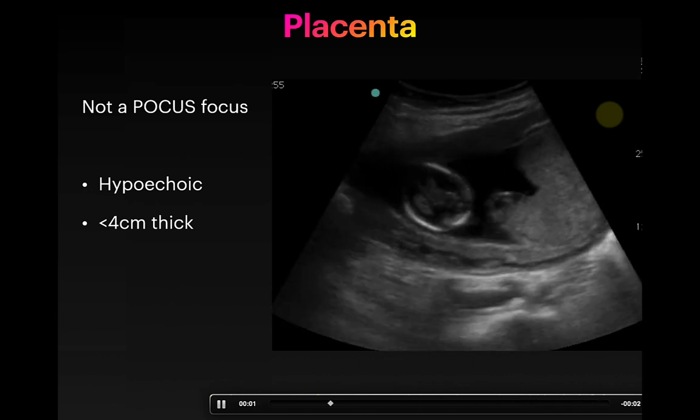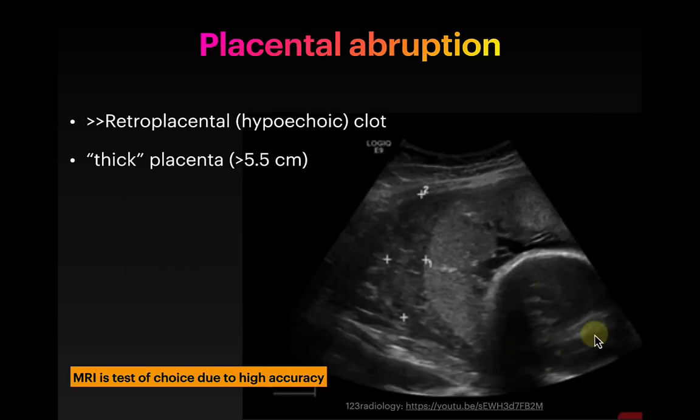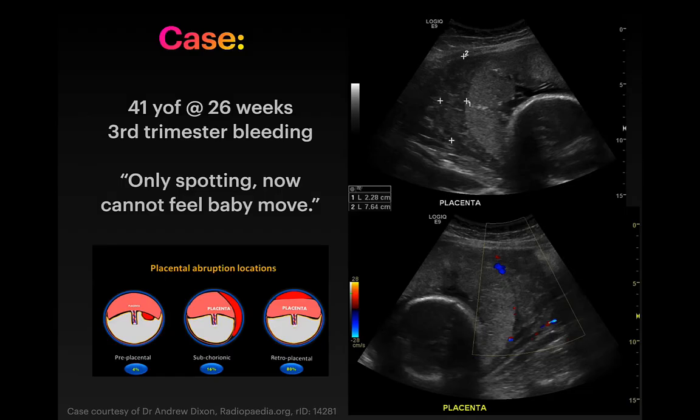So if you see a placenta that looks like this, where there's a baby head, and then there's a blob, and then there's another blob here before we get to the uterus that's bigger than the baby's head, that can be what's showing right here, which is a placental abruption. So if you remember from the pregnancy cases that you've seen in the past, placentas can start to separate a little early and you have bleeding. It can sometimes be hidden, which in this particular case here and here, it would probably show up as vaginal bleeding. But up here it gets hidden.